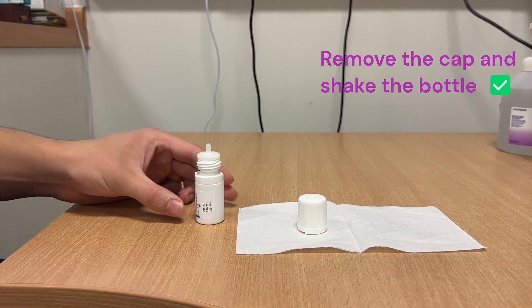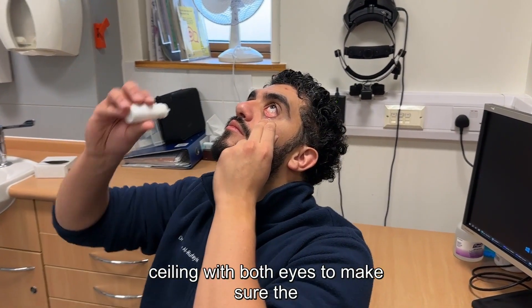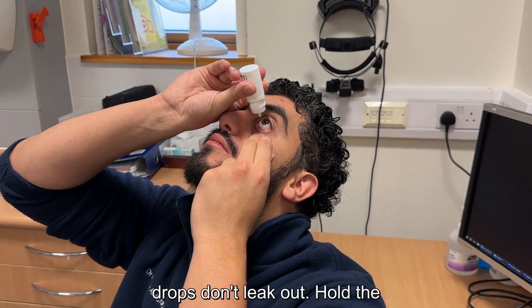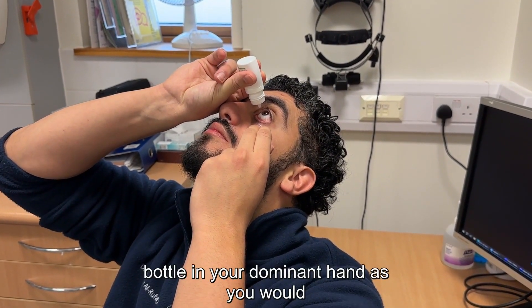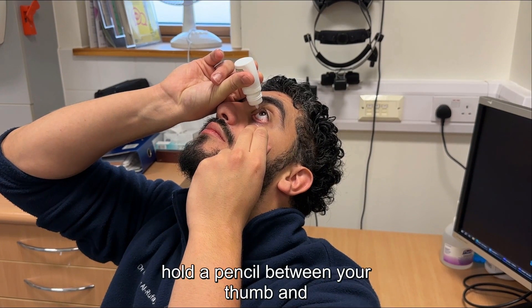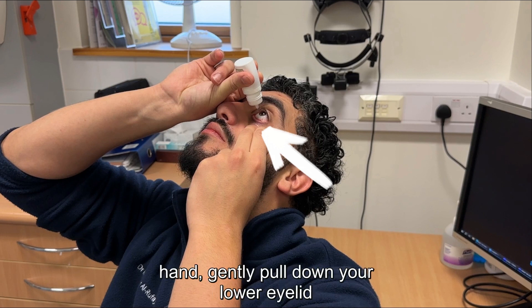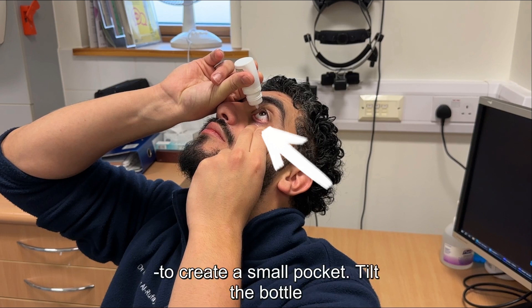Now, shake the bottle. Tilt your head back and look up at the ceiling with both eyes to make sure the drops don't leak out. Hold the bottle in your dominant hand, as you would hold a pencil between your thumb and index finger. With your non-dominant hand, gently pull down your lower eyelid to create a small pocket.